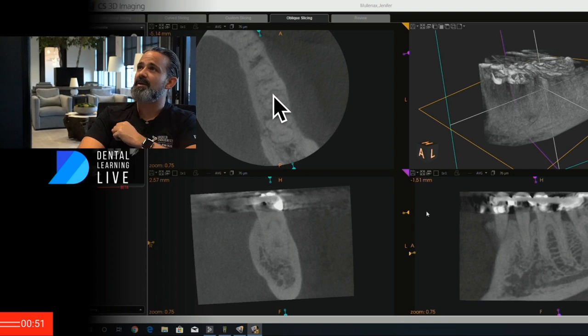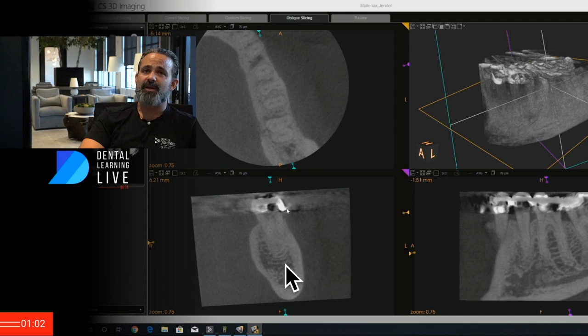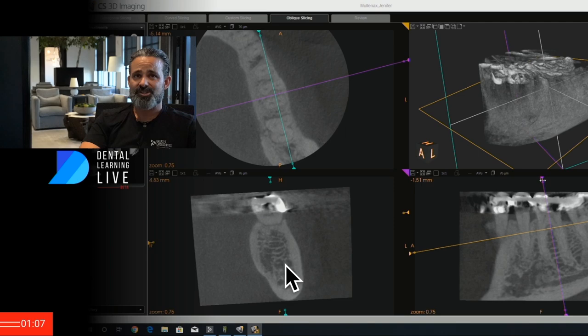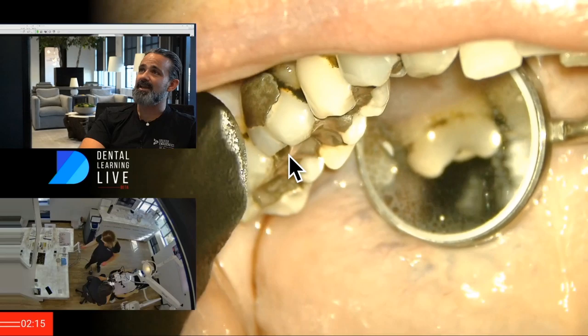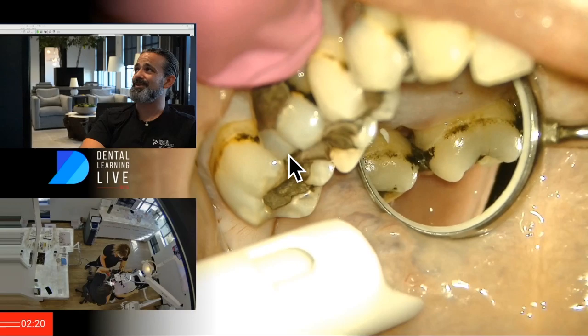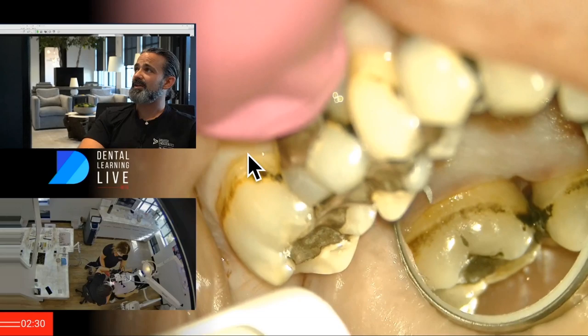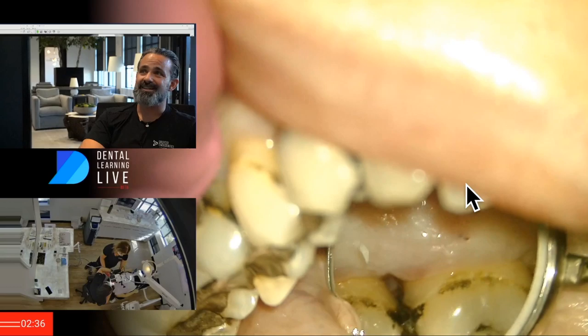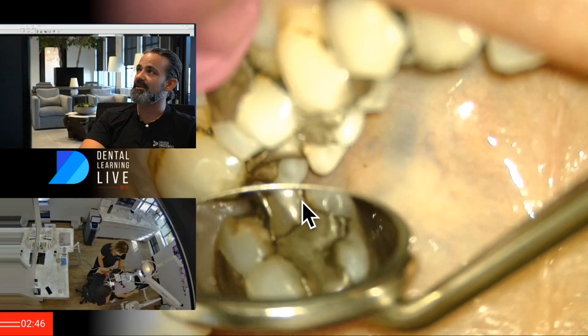I'm perceiving that those canals are connected, so I know I've got lateral anatomy galore. Nothing much periapically — no rarefaction, just normal anatomy. It's not percussion sensitive but it is very temperature sensitive, and that's the presentation. We've got this MOD going on, and I choose not to place a rubber dam initially because I want to open up the boxes so the rubber dam can seat underneath the contacts. You can see the defect where that wall is missing. This tooth is slated for a new crown.